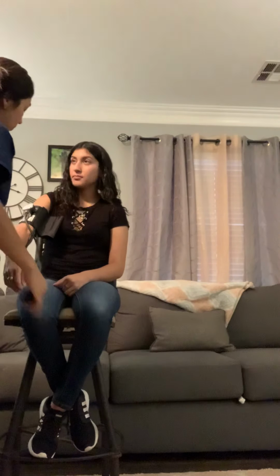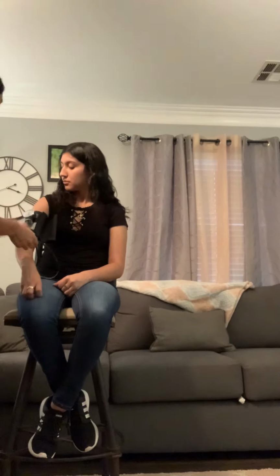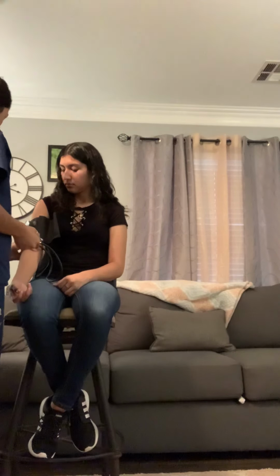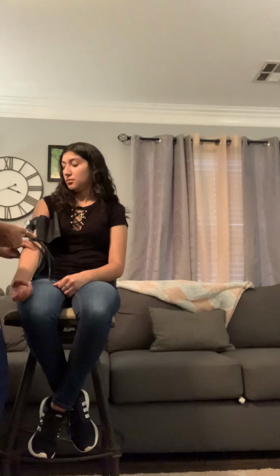If I was doing blood pressure on a kid, I would get a smaller blood pressure cuff. If I was doing it on someone a little bit bigger than you, then I would make sure to get the larger blood pressure cuff. But this one's the right fit. So I'm going to palpate that brachial artery, and I'm going to pump the cuff up until I can't feel your pulse anymore.